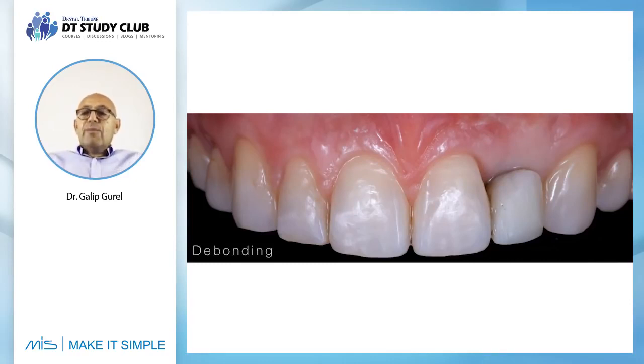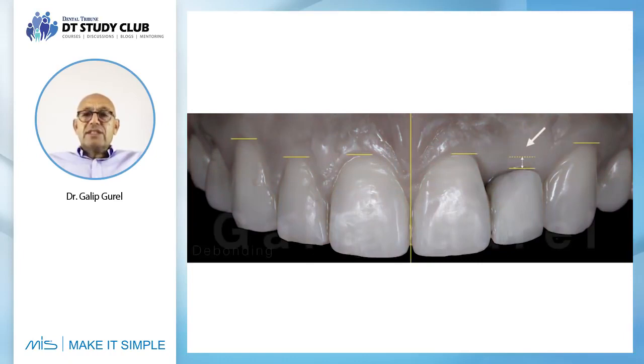We have more than plenty of space in that zone, where the root was exposed and it was almost up in this level. Thanks to ortho for bringing everything down, thanks to augmentation that builds up the soft tissue, thanks to connect and the way we shape the soft tissue at time of surgery to give us all the support for such a design.